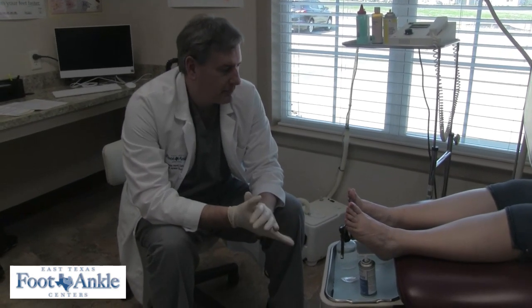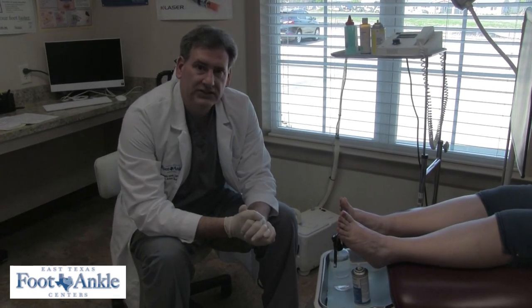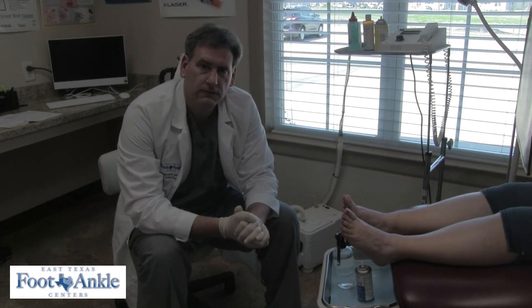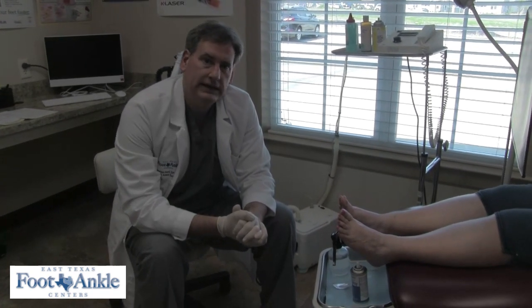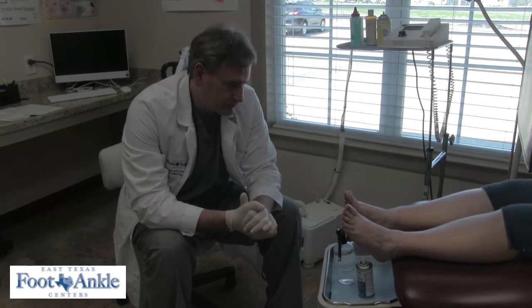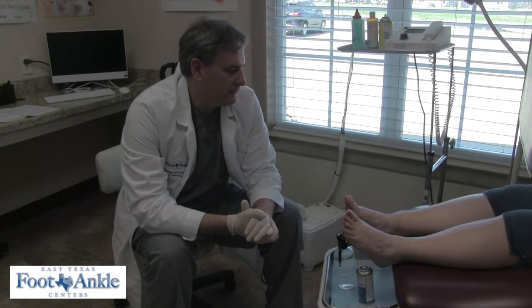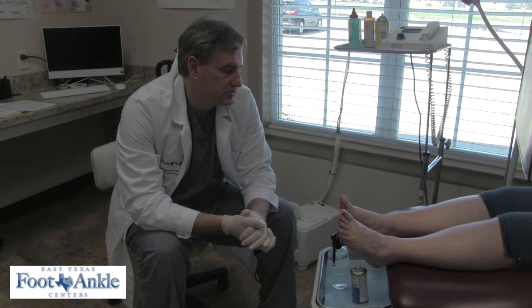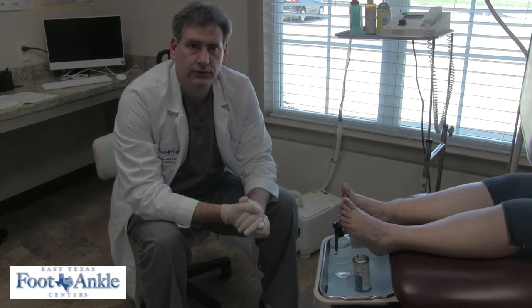So here's what I'm going to do today. I'm going to show you an epidermal nerve fiber density test. What we're trying to do is take a tiny sample of nerve fiber and show you what it says — how many nerve fibers are left. Usually when a person suspects they have peripheral neuropathy, this is the gold standard. We use a company called BACO, based out of Georgia. We've done it for years, and it'll be interesting to see if this patient truly does have peripheral neuropathy.